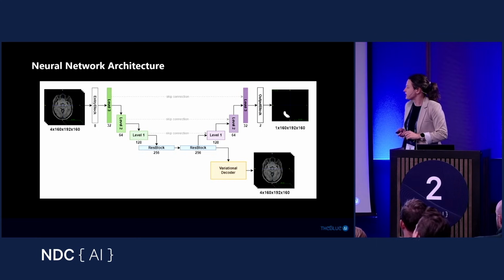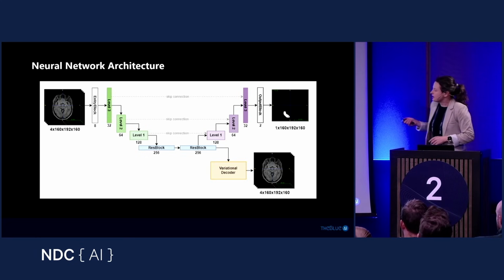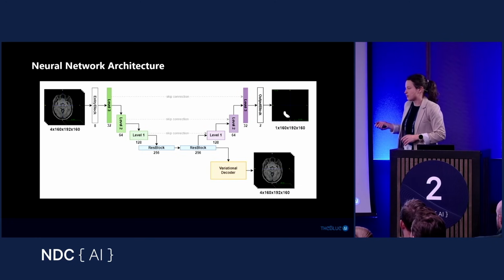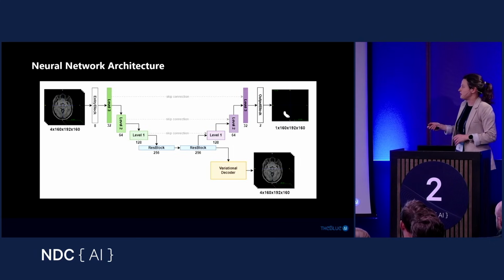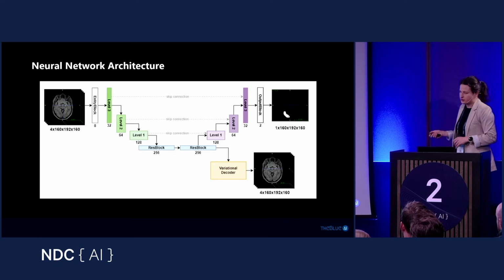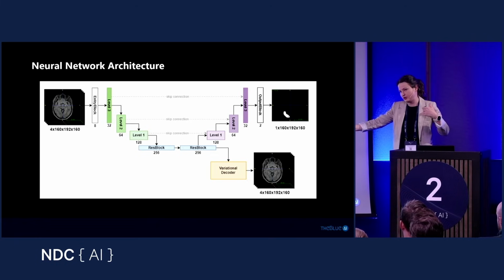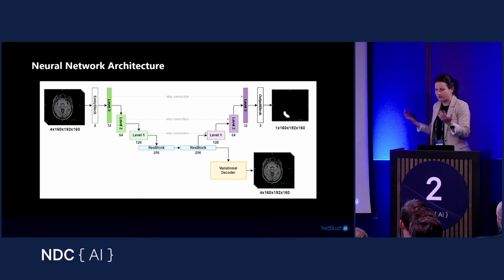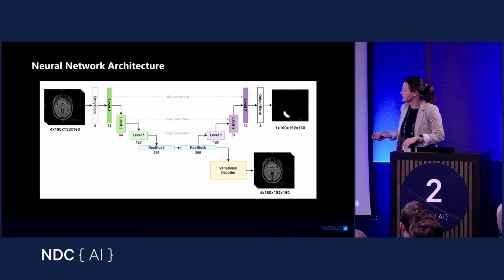Just a very short recap of how it works. The UNet architecture is a variation of the encoder-decoder architectures. The first part of the U that we have is the encoder. It's basically compressing the information. So from a big image that we have with a limited number of channels, which are 4, we're making it smaller and smaller and creating abstract features. So at the end here in the bottleneck, we have quite small images, but with quite many features, which are encoding specific features like some type of lines and edges and stuff like that.